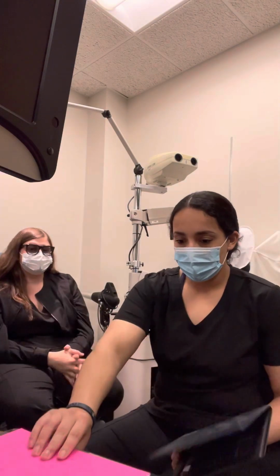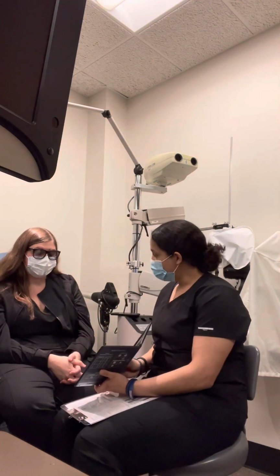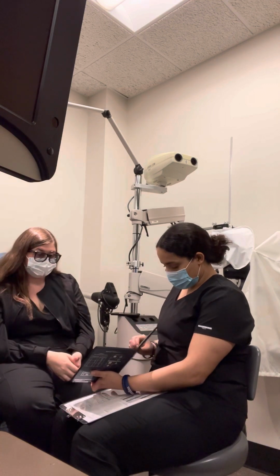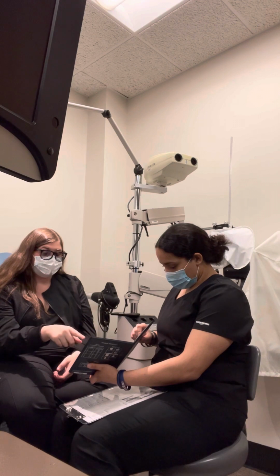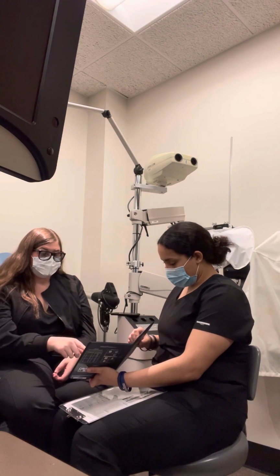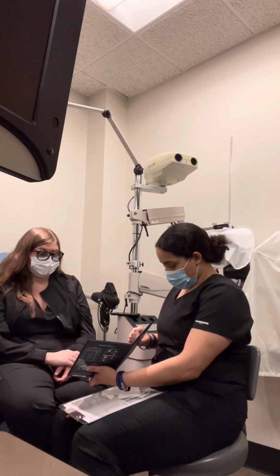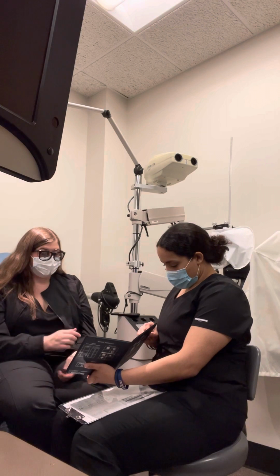Okay, so first of all, do you see any glare? No. In this booklet? Okay, awesome. So in this upper quadrant right here, please let me know what just pops out at you. Circle, star, nothing, E. Awesome. And in this lower quadrant right here? Square, triangle, cross, nothing. Okay. And in this vertical box right here, what pops out at you? R, plus, L. Awesome.